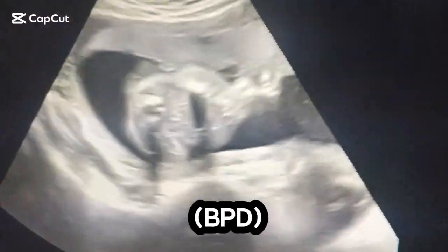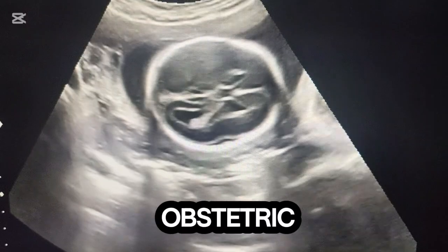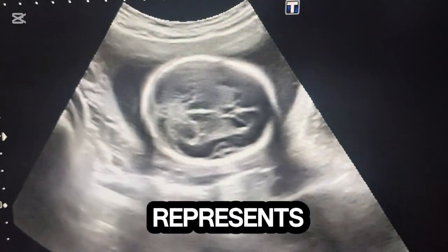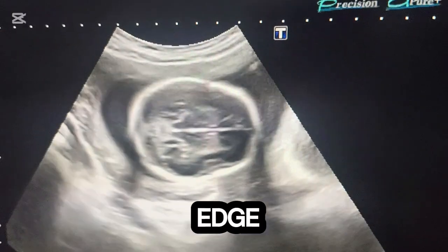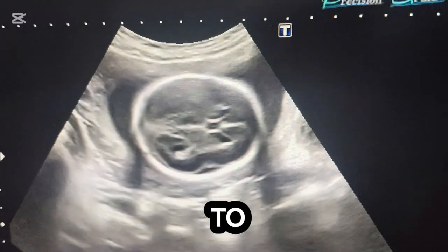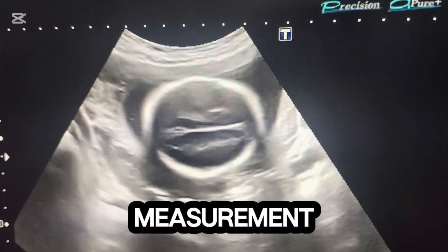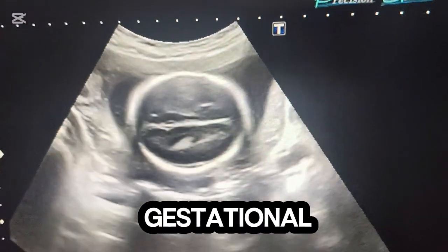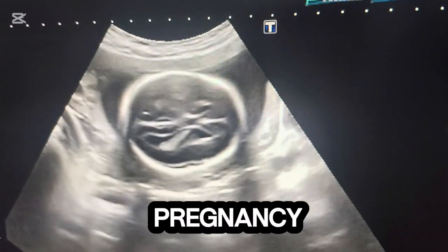Biparietal diameter (BPD) is an essential biometric parameter measured during obstetric ultrasound. It represents the transverse diameter of the fetal head from the outer edge of the near parietal bone to the inner edge of the far parietal bone. Accurate BPD measurement helps estimate gestational age, assess fetal growth, and monitor development throughout pregnancy.